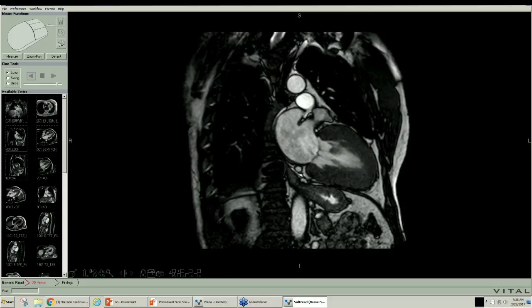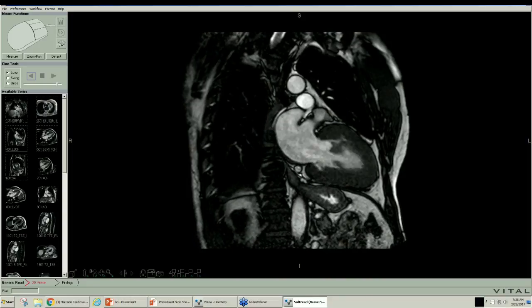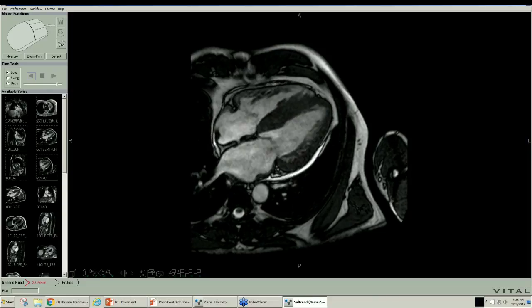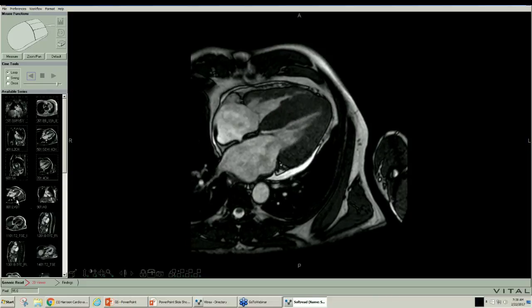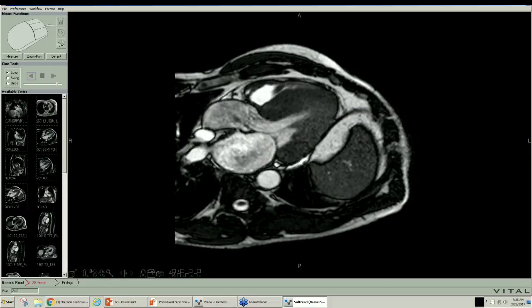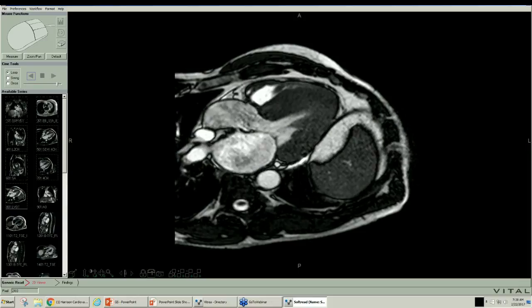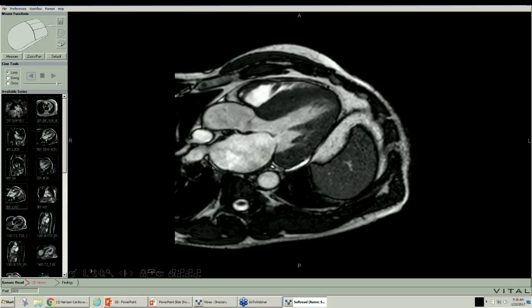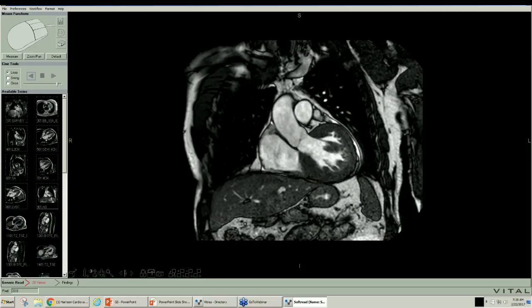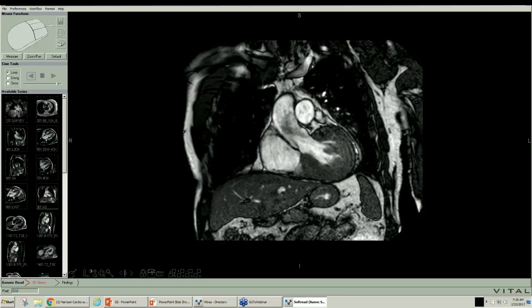Again, the gold standard, a little mitral regurgitation. Four chamber view, little TR, little MR, more of the same. Outflow tract, definitely not hypertrophic cardiomyopathy. Definitely not. Definitely not tunnel left ventricle or apical hypertrophy. But very pretty pictures. No aortic valve disease of any significance.